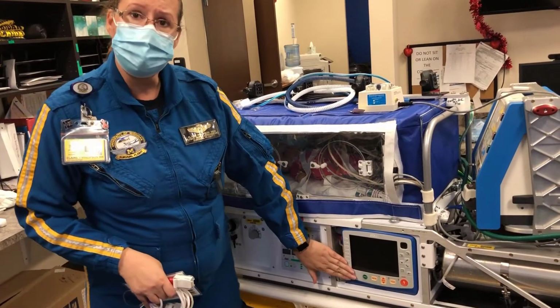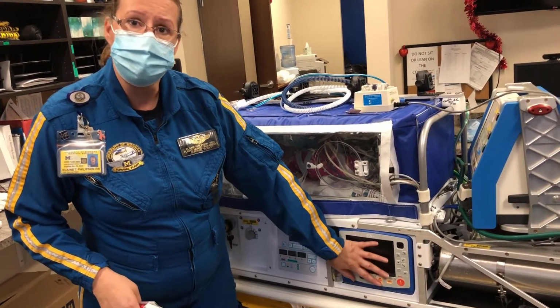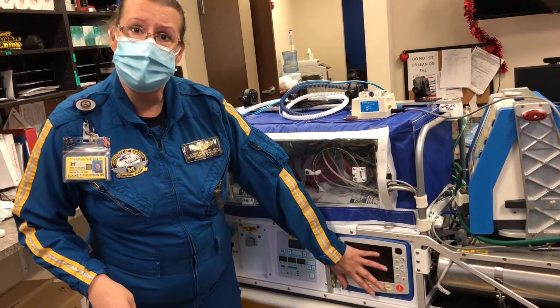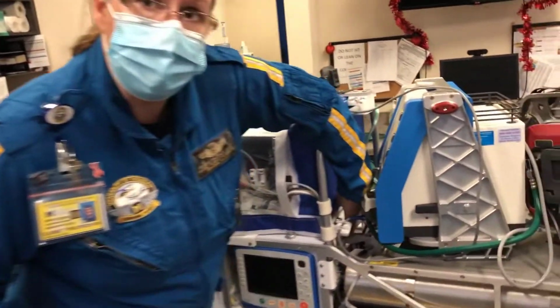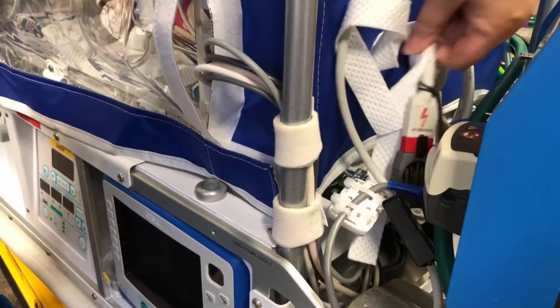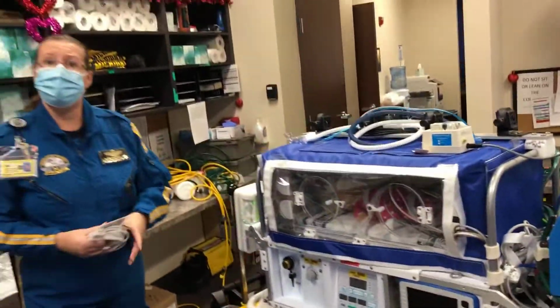Your patient temperature will show up as your T1 on your Zoll, and you do have defibrillator capabilities built into this monitor, so you do not need to take an extra transport monitor, and the cord is down there. The defibrillation cord is here, and defibrillation patches have been added to the Brandon bag.